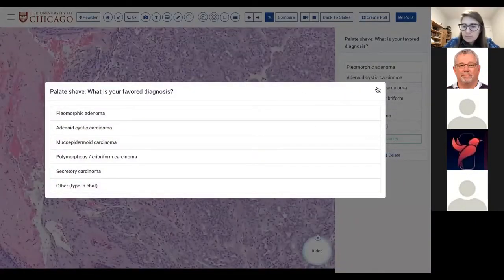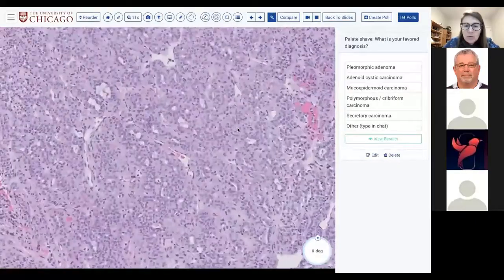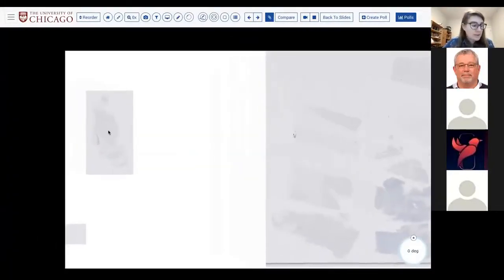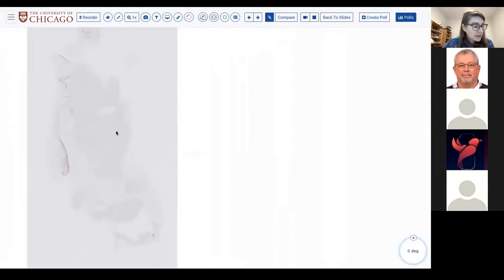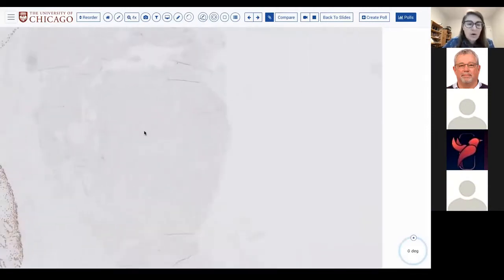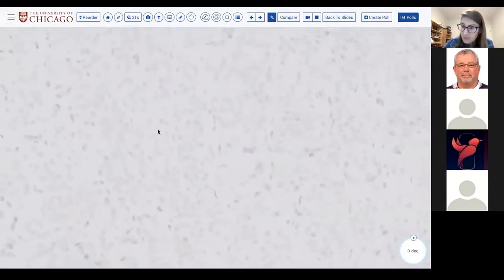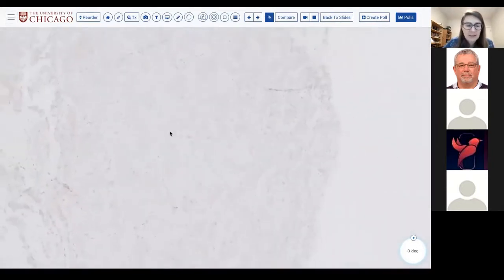All right, so you may want to start in the same vein, okay? You may want to start with a P63, P40. In this case, we're going to go straight to the big guns. We're going to go straight to P40 because, as I said, it is more specific, and it's completely negative.